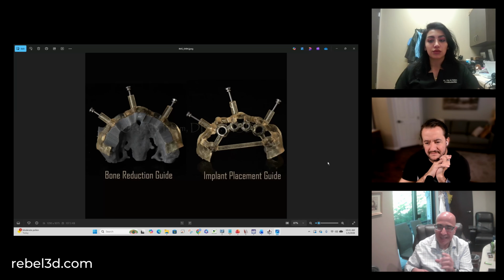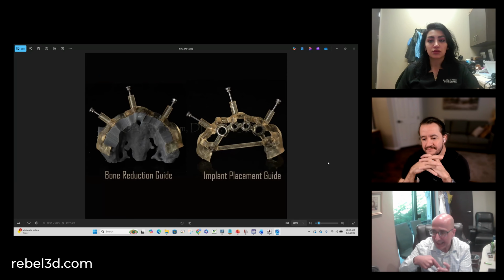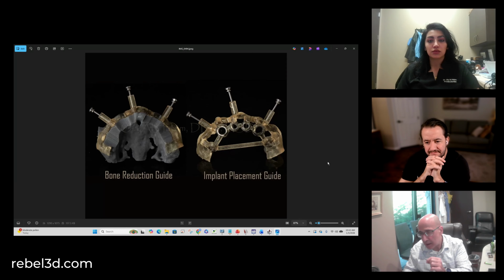So having this one sometimes in the socket makes problems like that. You have to go straight on exactly, and sometimes the drill's not strong enough and it can slip or break during such a thing. Make sense?